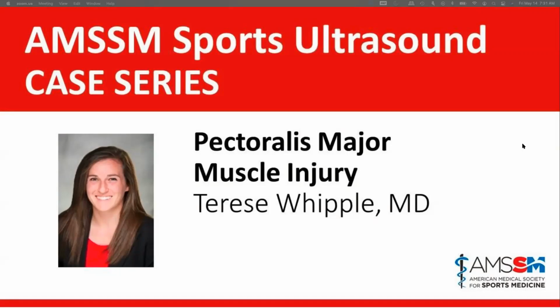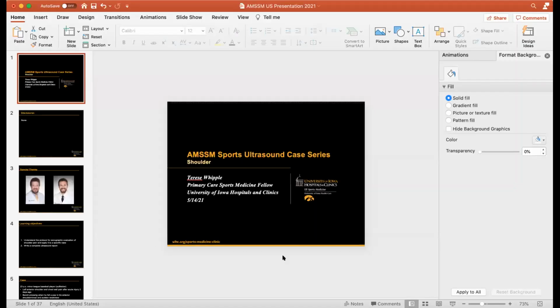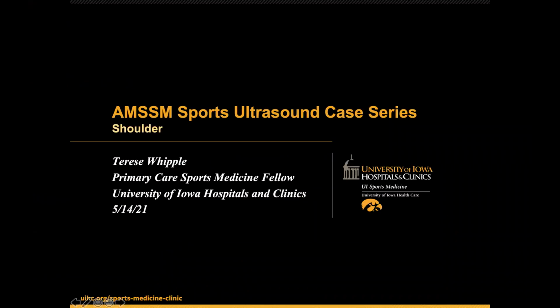All right. Thank you very much, Dr. Cruz. Can you see this okay? Yep, that looks great. All right, perfect. Like Ryan said, my name is Terese. I am one of the current fellows at the University of Iowa. And I'm going to be talking through a case of shoulder pain with a little different pathology than the case that Dr. Hall had presented earlier on in this case series.